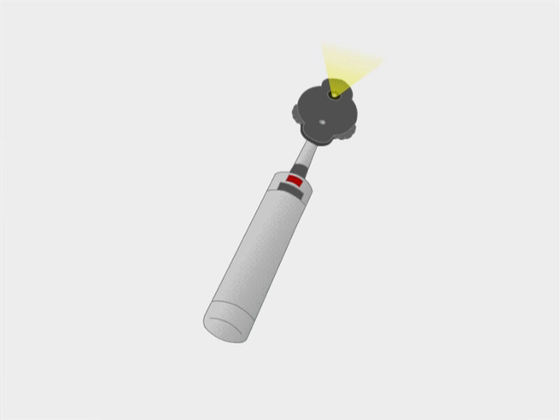The use of the ophthalmoscope is an important tool in making a clinical diagnosis beyond the realms of ophthalmoscopy. Examination of the eyes, especially the fundus, is important as it may reveal signs of pathology in many systems such as endocrine, neurological, cardiovascular, as well as being a useful tool in general medicine.